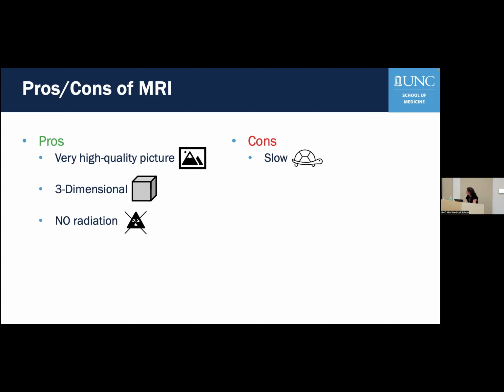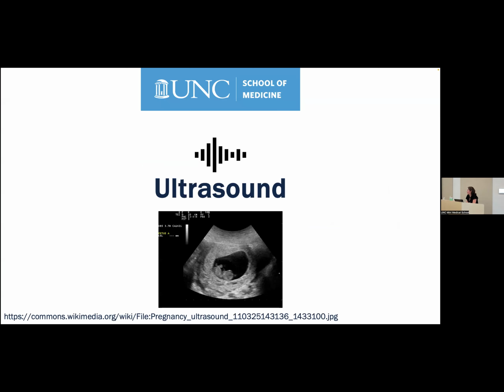Some cons of MRI: it's pretty slow, takes a while to take all those pictures. It's very expensive. And that is it. So moving on to ultrasound, which is going to be the rest of our session here. This is just going to be a quick overview.